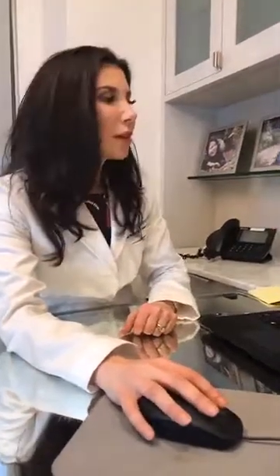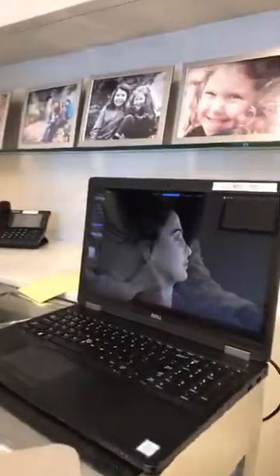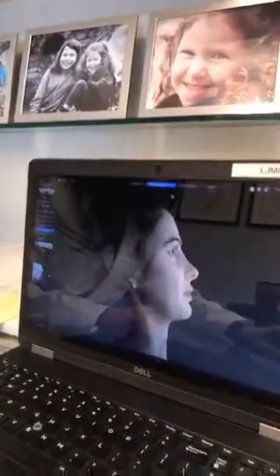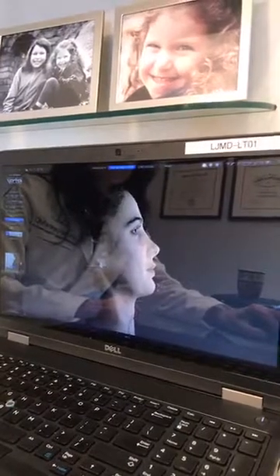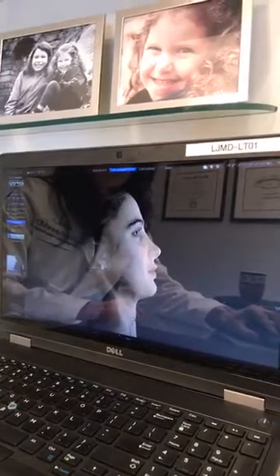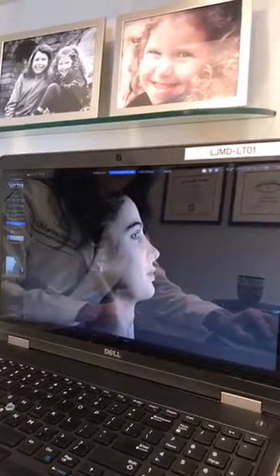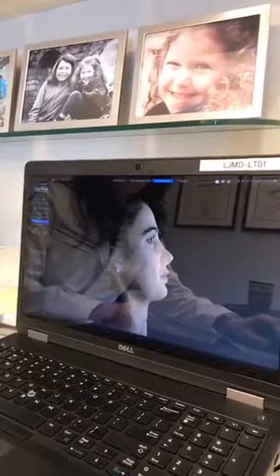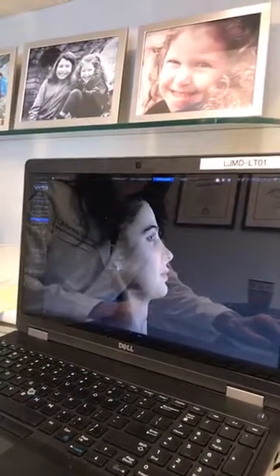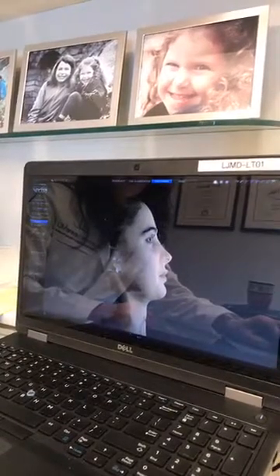Oh, okay. So this is also really helpful for showing the chin augmentation. As I said before, very often someone doesn't know what changing their chin will do for them, but you can see with this program it's quite easy to change the chin. The other thing that's very helpful is that we can look at all different things.